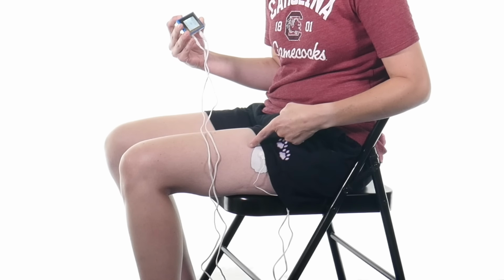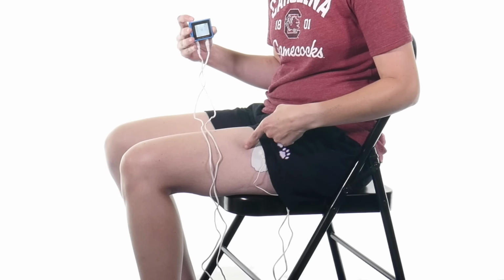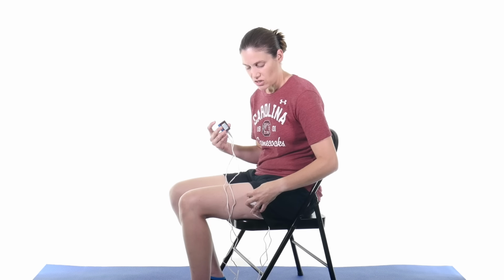I don't know if you can see that. I'm gonna go even higher. If I'm getting that contraction, that means it's too high. You don't want to actually see the muscle contraction because then you're fatiguing out that muscle and that's not the goal of the TENS unit. So if you're getting too much with that and you see a muscle contraction, especially on other parts of the body that don't have as much meat on them, you might just either need to change the placement of electrodes or just go down in the intensity a little bit.